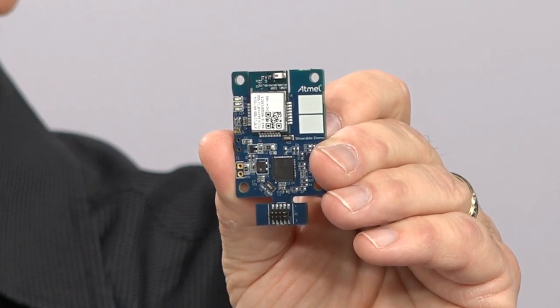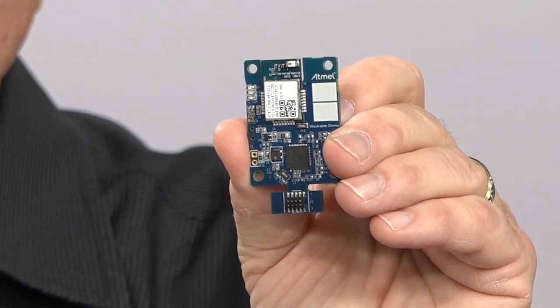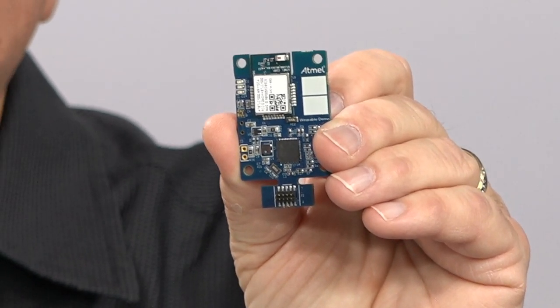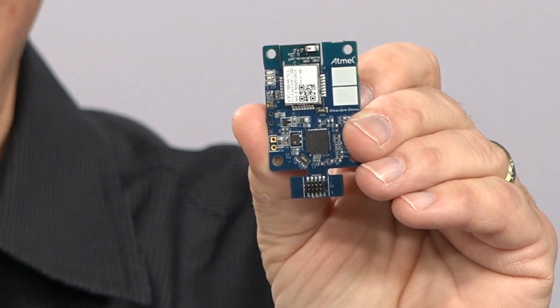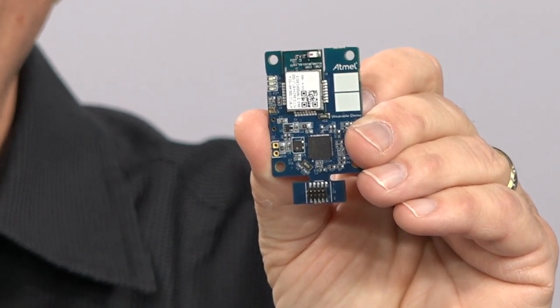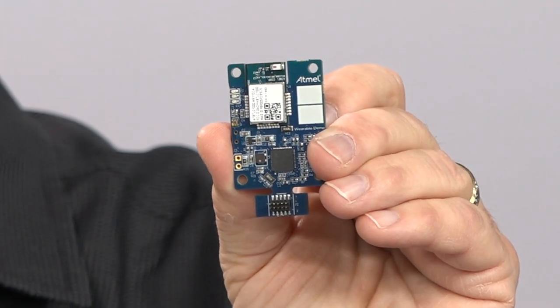And so how this matters with patient compliance is that a similar design using a lot of the same ideas, if you start with this baseline, you can start looking at things like: are they taking the right dosage? Are they taking it at the right time? Are they moving it? A doctor would worry that someone on a nebulizer may push the button but spray the medication out into the air, and then come back and claim, well, I'm still sick, this medication isn't working. Well, the doctor can look and say, we noticed you moved it out of position, which showed us you weren't using it properly. So it's important not only to get the data, but for protection, obviously. But mostly it's important to get all the data: are they using it properly overall?